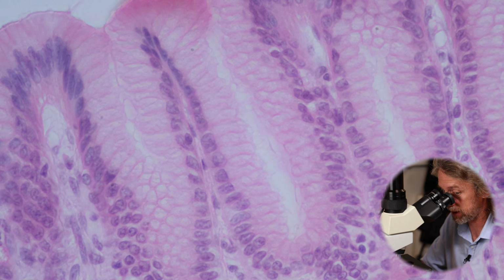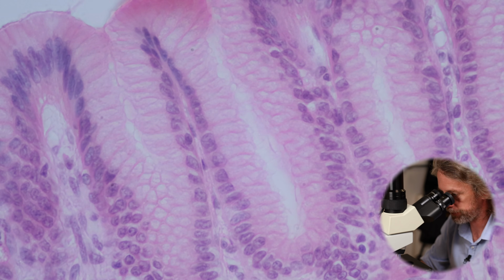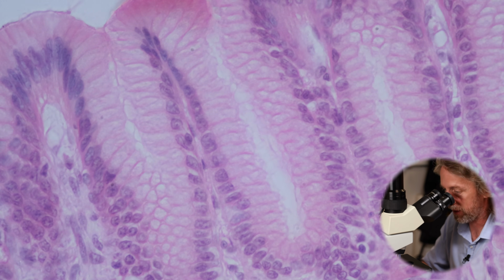The nucleus is down towards the bottom, so essentially this is a very folded epithelium, and all those epithelial cells will still be attached to a basement membrane. So the nuclei are near the basement membrane, near the bottom of the cell. Then we've got lots of cytoplasm extending towards the surface, and the cell's producing a lot of stuff that's going to be released from the surface of the cell into the lumen or into the gastric pit.